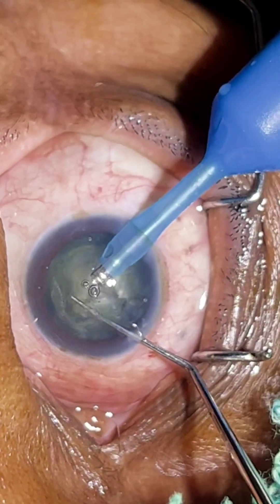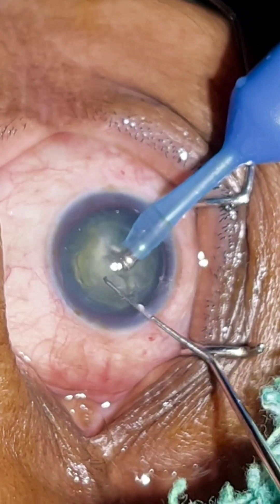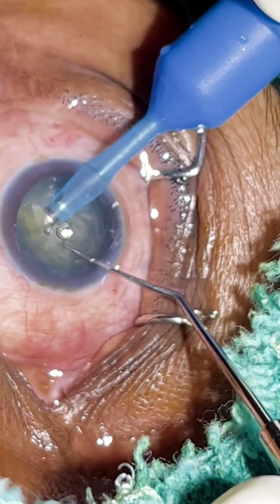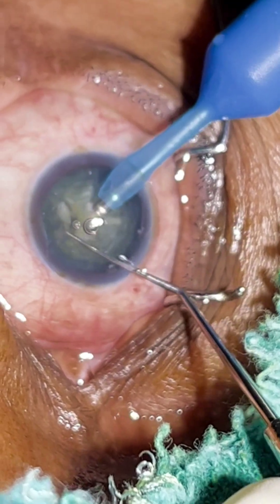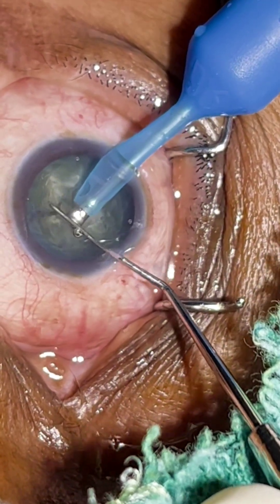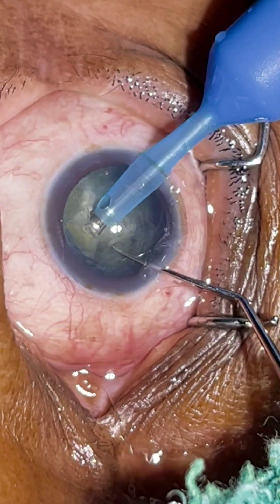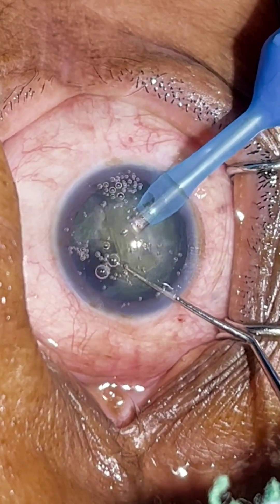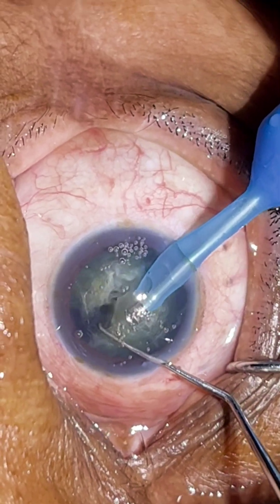I usually don't emulsify at this stage. I prefer to complete the chopping first, make the hemi-nuclei into further smaller fragments, and then go for emulsification. Now the chopping part is complete. Emulsification is done at the level of the iris, slightly below the iris.